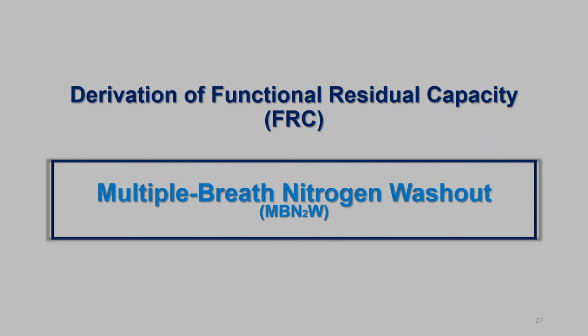When possible, lung volume measurements should precede forced expiratory maneuvers, which could induce bronchoconstriction and thus shift FRC or reduce VC. And as a reminder, the VC maneuver should be performed during FRC measurement.